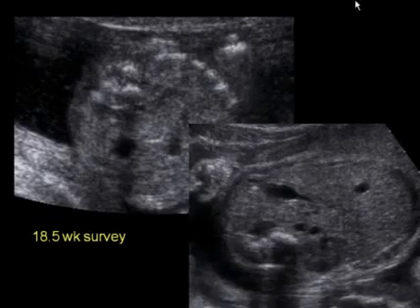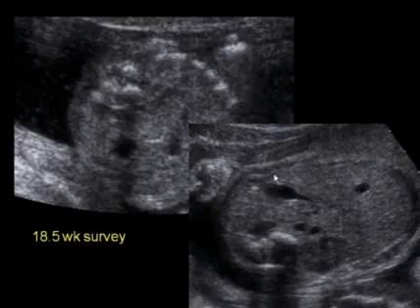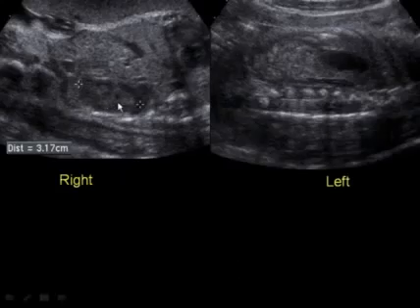And indeed, when this patient returned at 30 weeks, again, here's the right kidney, aorta, IVC, stomach bubble, and a little hypoechoic area here, but no definite kidney seen in the left renal fossa. Sagittal images of each kidney were performed. Here's the right kidney, 32 millimeters, right where it belongs, under the diaphragm. But on the left, we see the lying down adrenal sign, where the adrenal is elongated and stretched along the spine because there is no kidney in the left renal fossa.